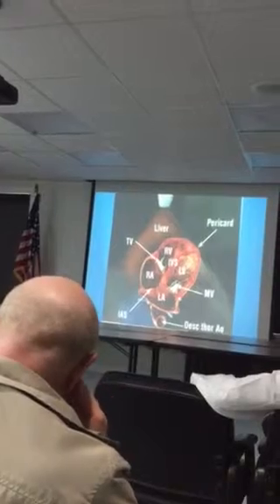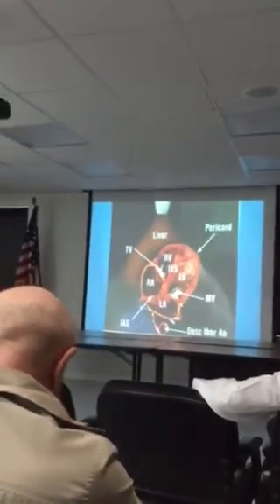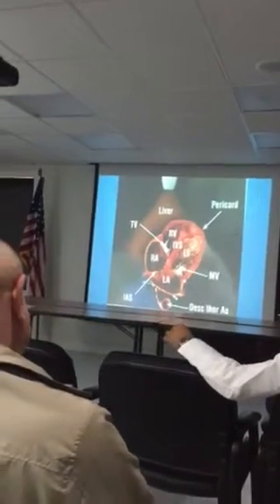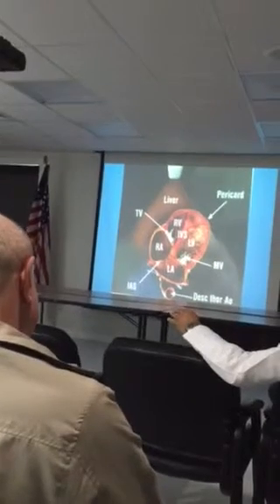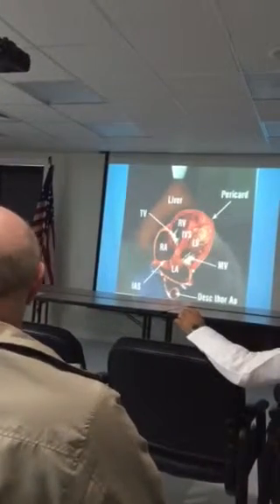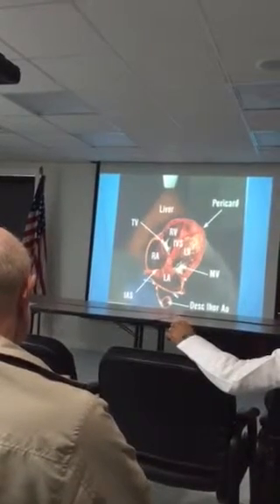Because when a pleural effusion comes close to the descending aorta, it is going to be wide, whereas the pericardial effusion is differentiated: wherever the pericardial effusion comes close to the descending aorta, it becomes so small and tapering here.